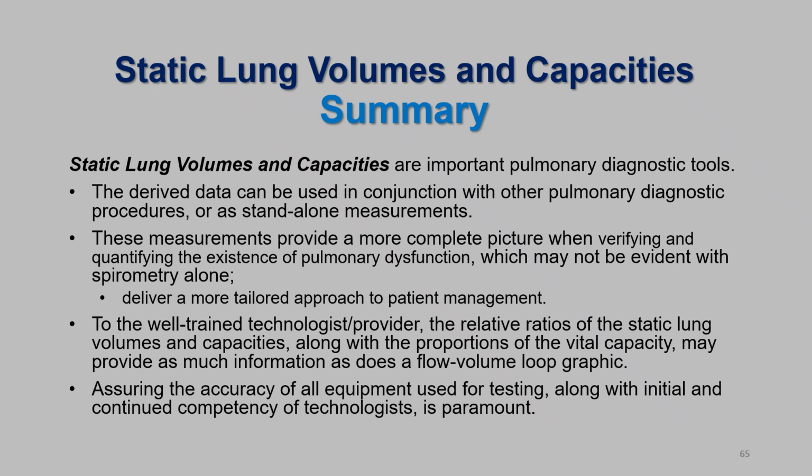Laboratories are encouraged to develop their own quality control programs and monitors to ensure testing is in accordance with published standards and recommendations. By standardizing the testing process, variability is reduced. Ultimately, test quality and patient management will improve.